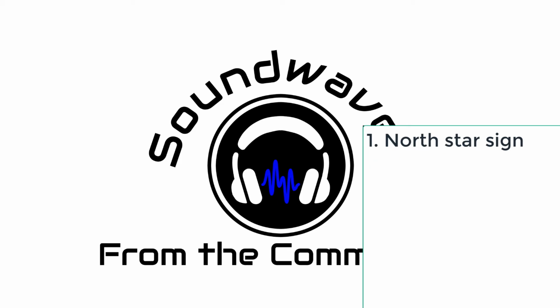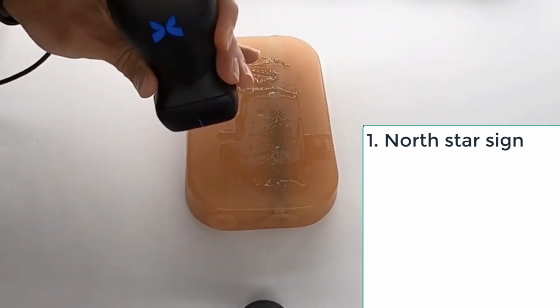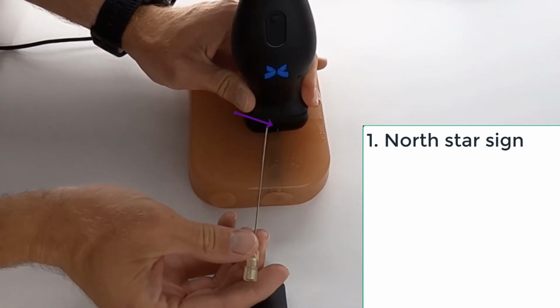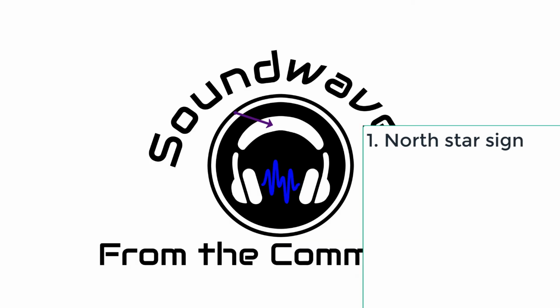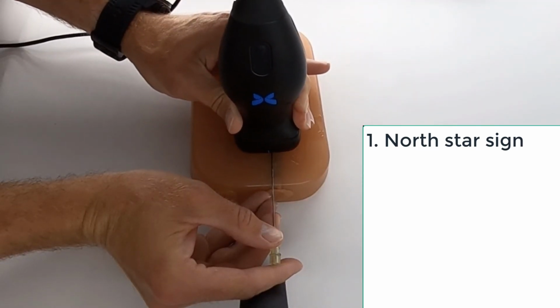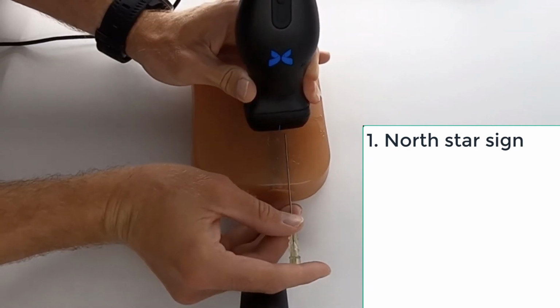So 1, North Star. This is a term that was coined at Ohio State, and I don't know who specifically. It might have been Dr. David Boehner. Someone else may have come up with it, but it was what we were taught when we were at OSU. Before you actually use the needle to penetrate skin, you want to get the probe on the patient, and you want to get the image centered, and there should be some sort of center marking on the probe, a triangle, little teardrop shape, something that points to the center of your probe. Then you're going to rest your needle right on top of the patient's skin, flat. You're not penetrating the skin. You're just resting it flat. This should not be painful at all. You lift up your probe and you put it down on top of the needle.